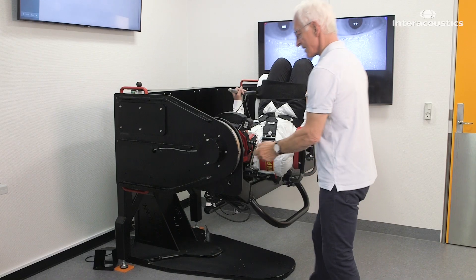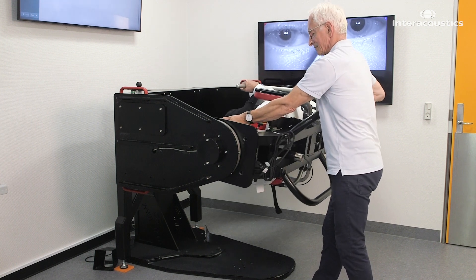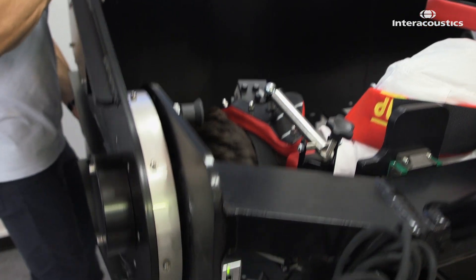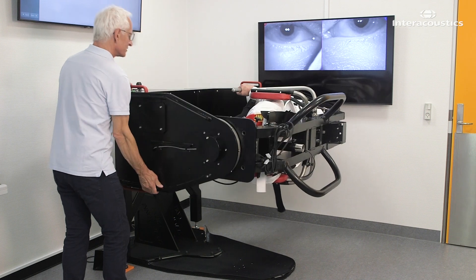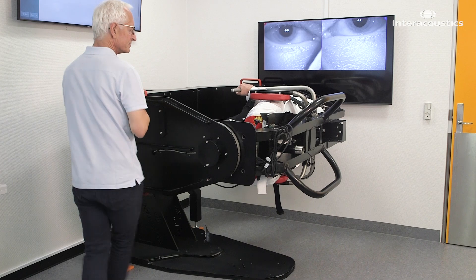For cupulolithiasis, bring the patient into a horizontal position with the affected ear pointing straight down. Apply 12 rapid decelerations in this position. Then press the foot switch to lock the main arm.